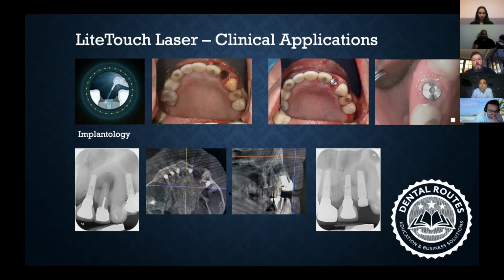And you can see the healing in the last picture over here. Today I saw him after 3 days, and primary healing is almost complete. And you can see there is hardly any inflammation present.